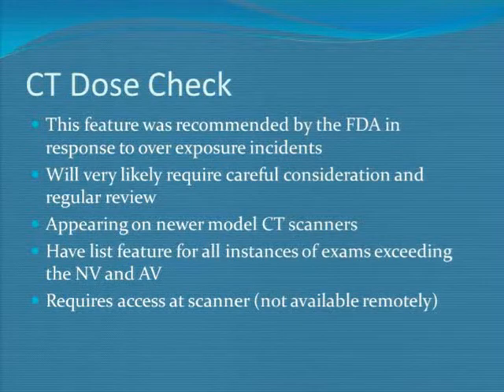This is going to be one of those protocol parameters that you're going to have to look at on probably an annual or biannual basis to make sure it's still meeting the needs. It's on newer model CT scanners for the GEs. It's definitely on the VCTs and up. We just got a brand new Siemens flash scanner, and for sure it was on that. I'm not sure how far back the other vendors go.